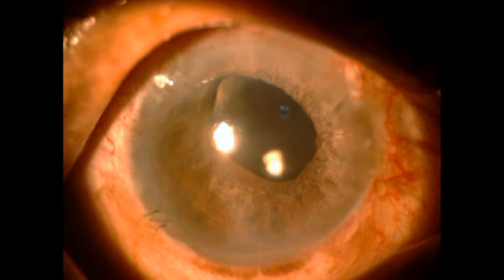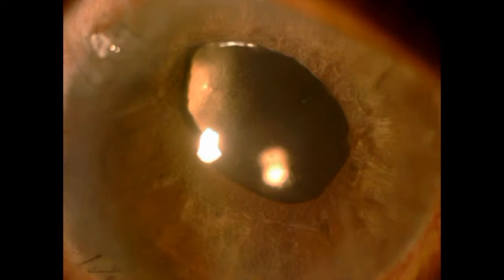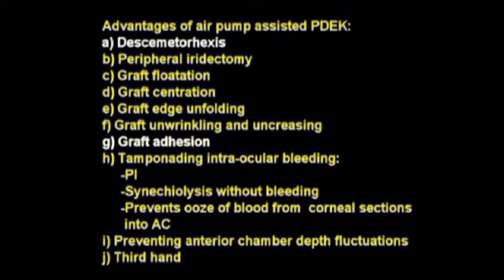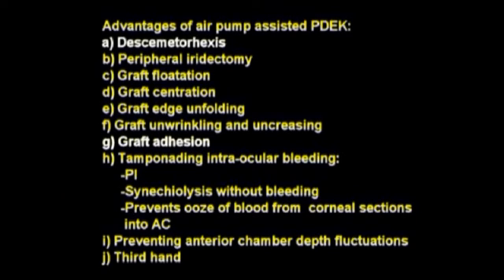You can see the post-operative appearance of the patient with a very clear cornea, a well-attached graft, and good visual acuity. Though the use of air has been described for desmetorexis and graft adhesion, my technique of air pump assisted PDEC utilizes air for a variety of other steps and with great advantage.